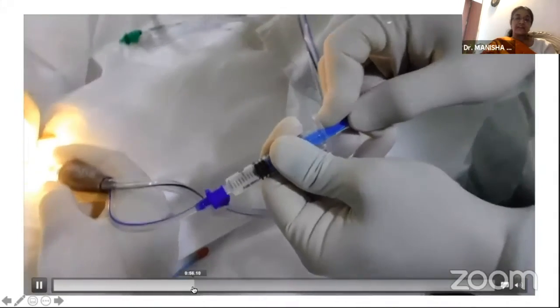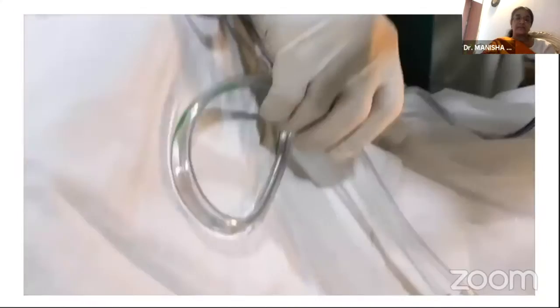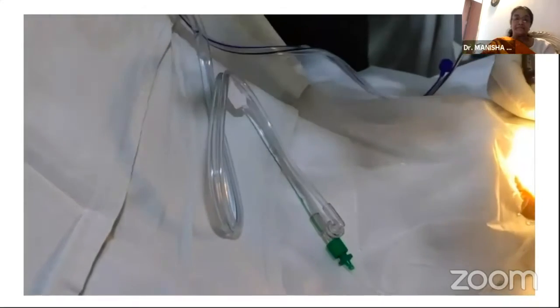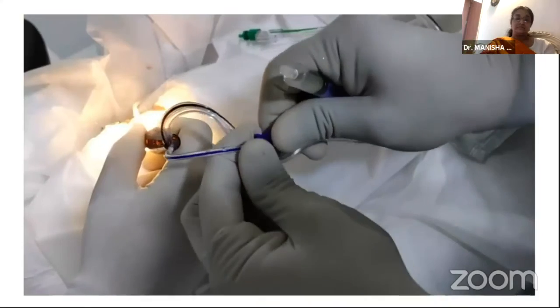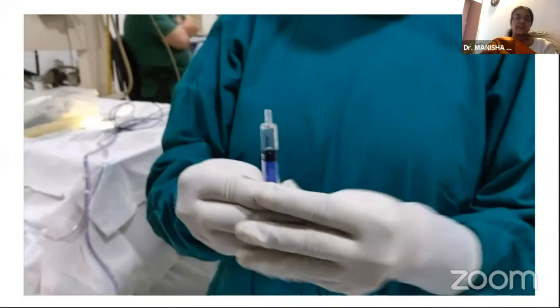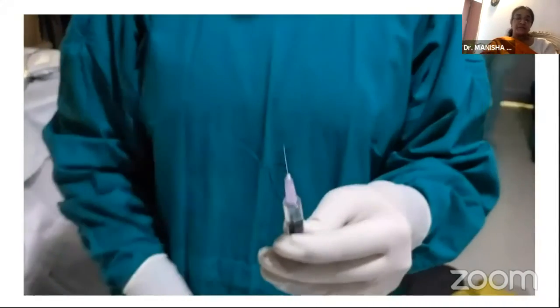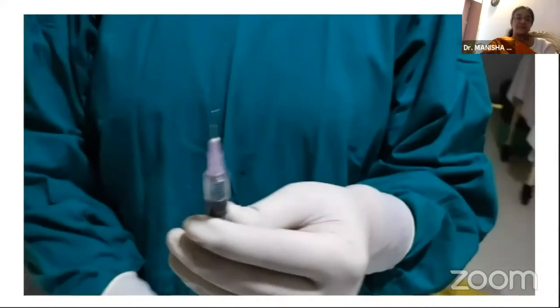So after you have actually collected the sample, you see this yellowish vitreous sample coming into the syringe. You can put on your infusion line. It's always a good idea to expel out all the air which is there within the syringe. Put a needle on top and rotate the needle to avoid any kind of contamination into the sample.